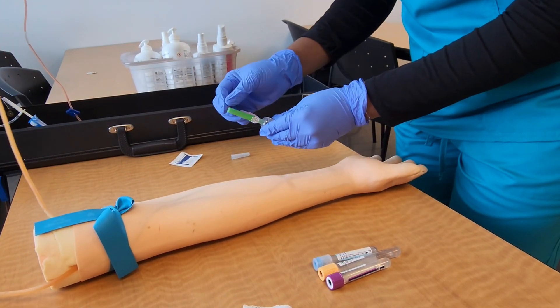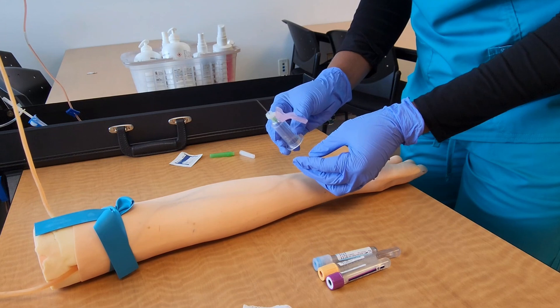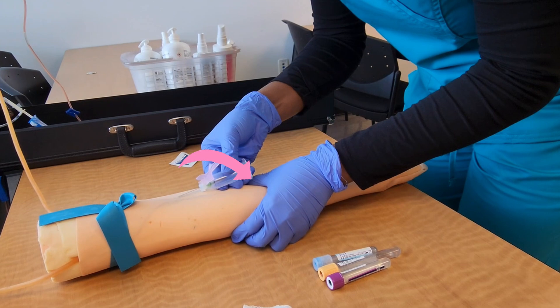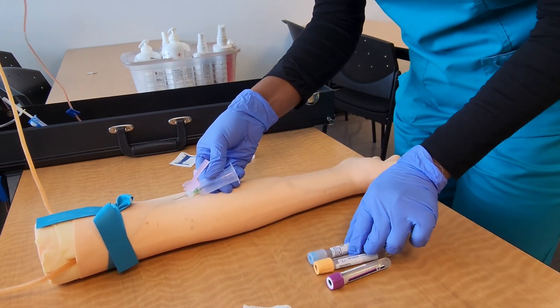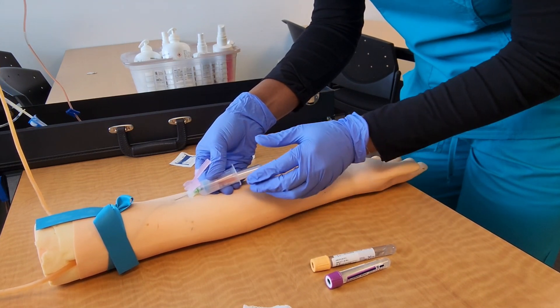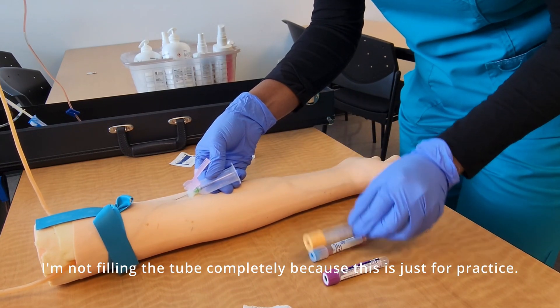I'll uncap my needle and quickly inspect it for defects. While holding my hub between my thumb and fingers, I'll use my other hand to anchor the vein by stretching the skin backward, then insert the needle with the bevel facing up at the correct angle. I'll go ahead and fill my tubes in the correct order of draw with the correct volume.